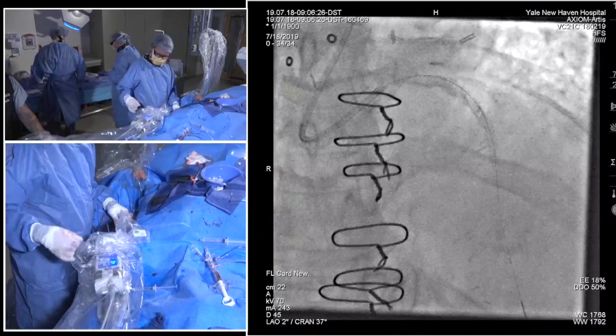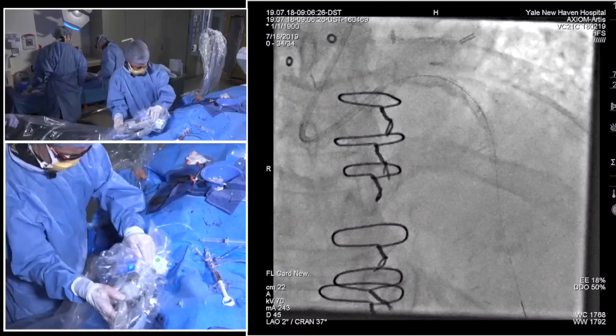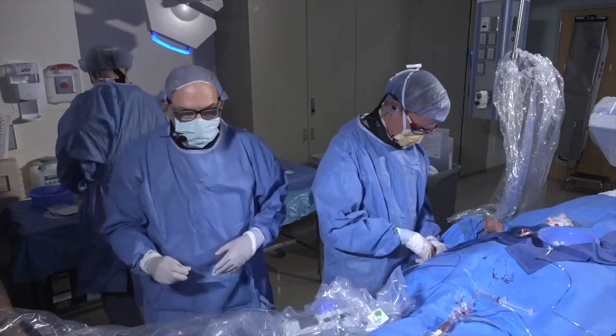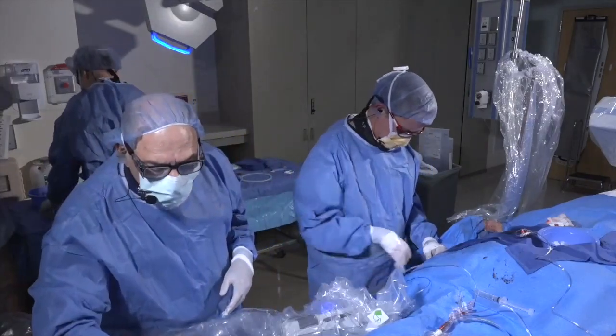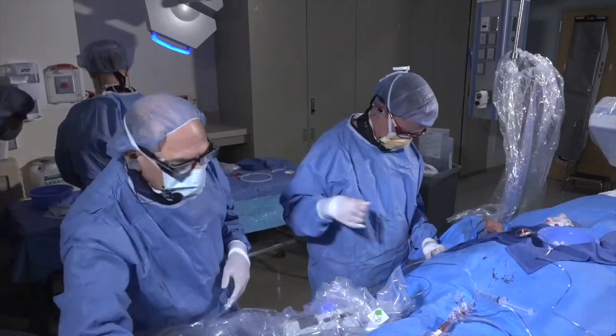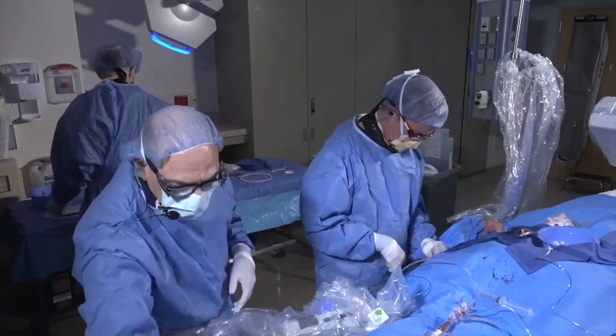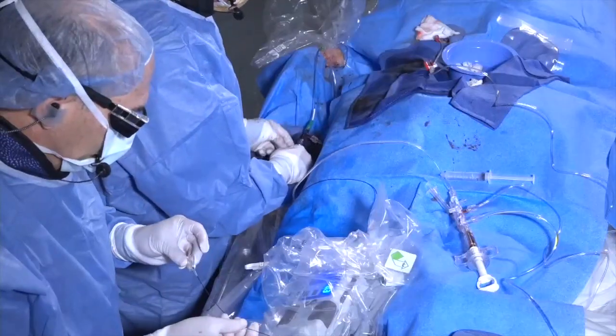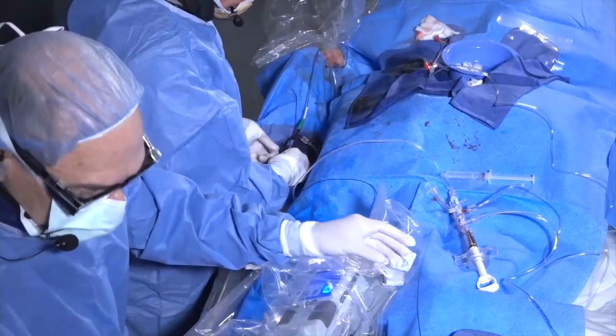And remember, the Synergy stent is reinforced at the proximal end, a modification that was made initially. But the truth is, any stent, if you push hard enough, you can do things to it. So it's much better to just go in, and he'll have a new balloon now and be able to modify it. Yeah.